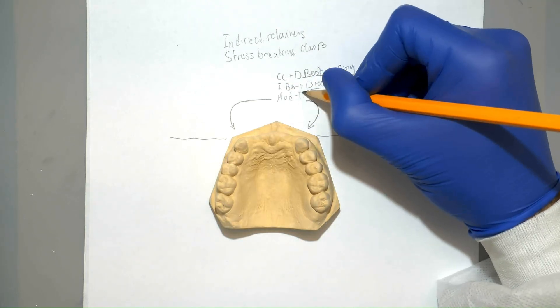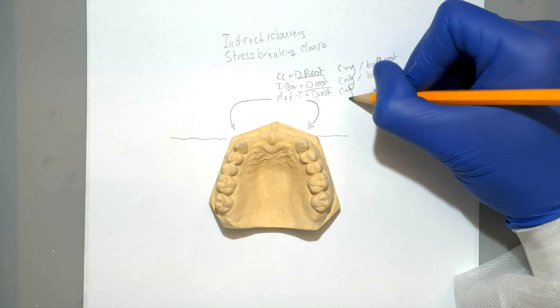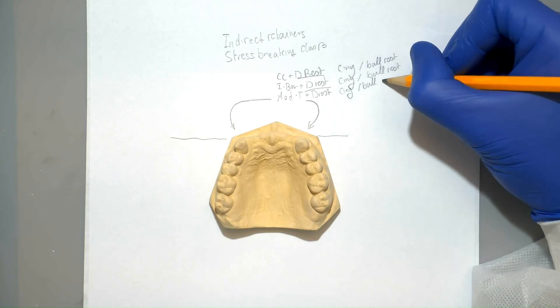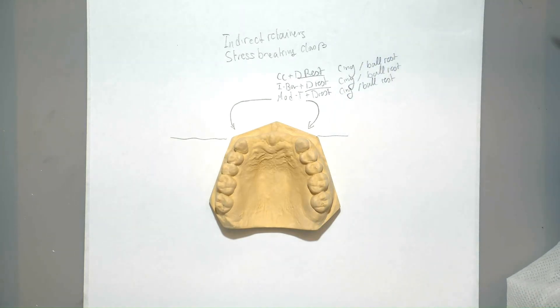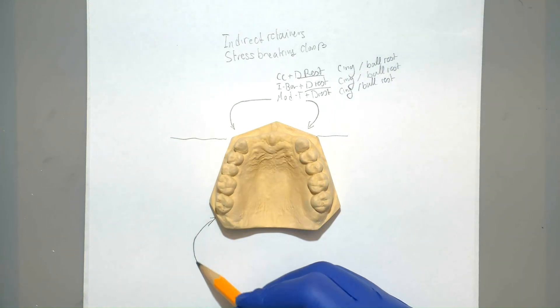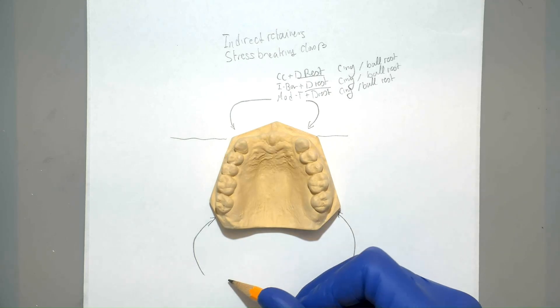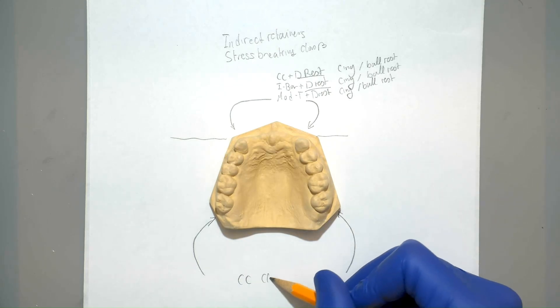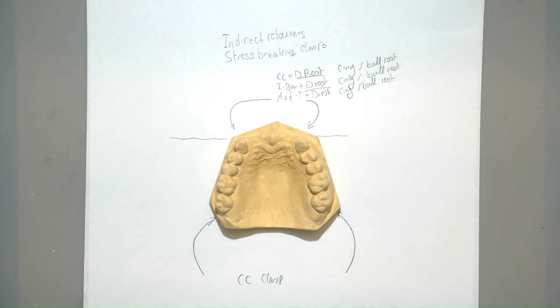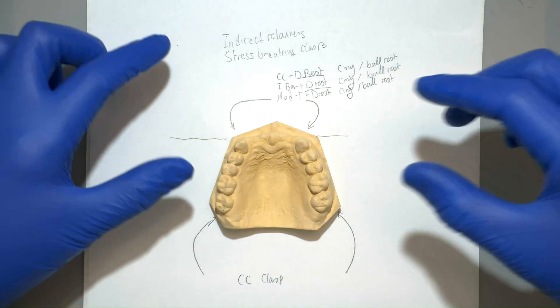We can also use a modified T clasp with a distal rest or a cingulum rest. On the posterior teeth, we'll default back to the normal cast circumferential clasp.